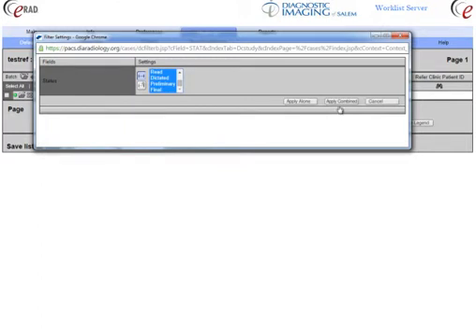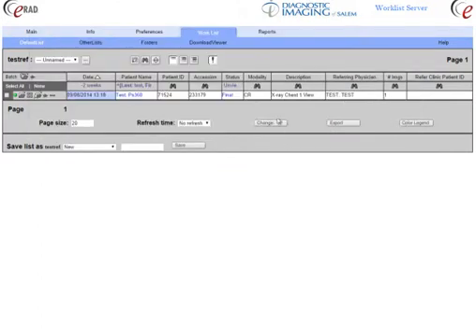I'm going to go ahead and apply this combined so that I keep my other filters. If I had applied that alone it would have shown me every patient in the system with that status.